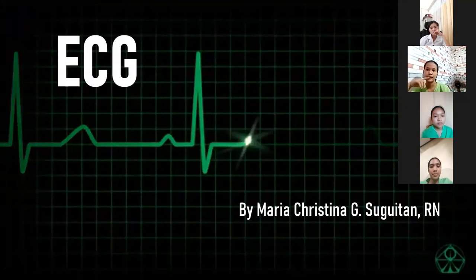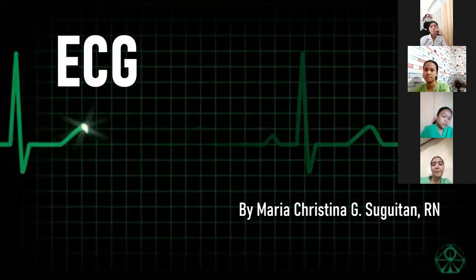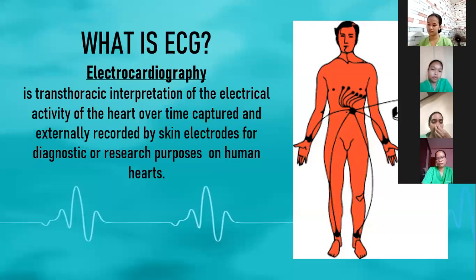So ECG, in short lang naman yung ECG para madaling sabihin, no? Ang ibig sabihin niya ay electrocardiogram, naka-British kasi, sorry. Tinatawag din po na electrocardiography. So, ano nga bang ECG? Electrocardiography or electrocardiogram is transthoracic interpretation of the electrical activity of the heart over time, captured and externally recorded by skin electrodes for diagnostic or research purposes on human hearts. So ito po ay nagbabasa ng pintig or ng rhythm ng heart.